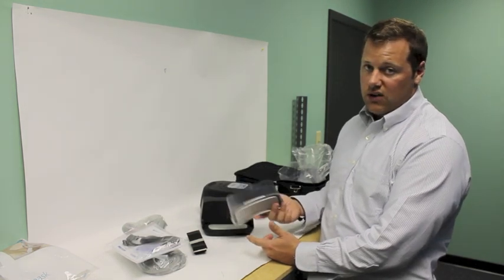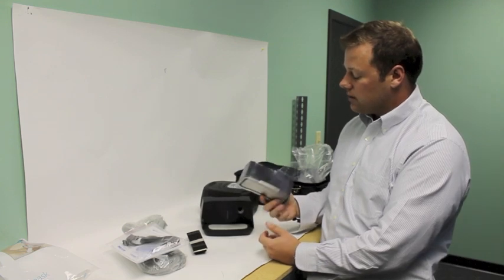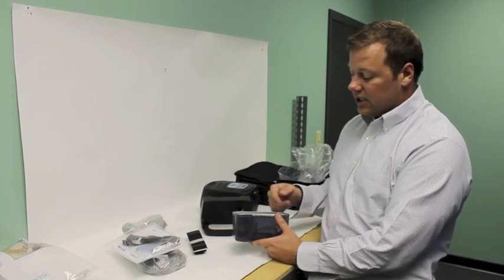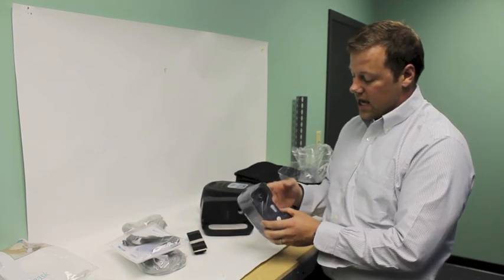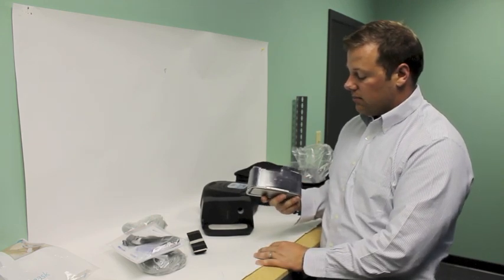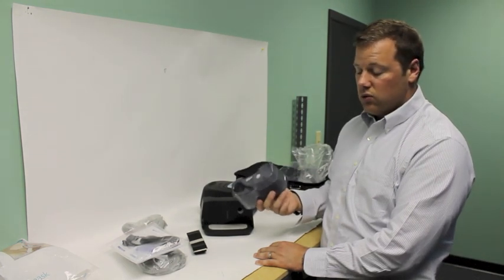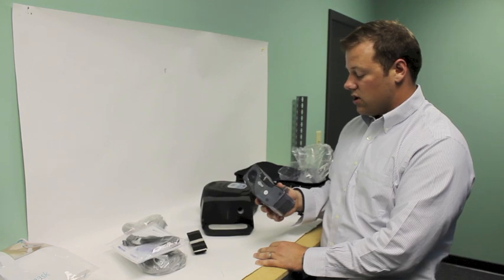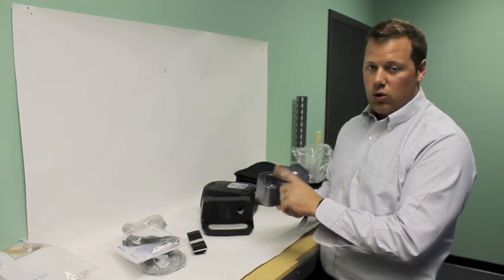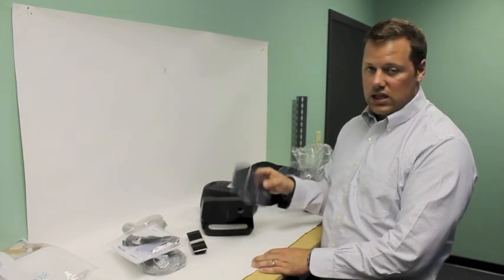In fact, every day you should be emptying out and drying your water chamber just so nothing builds up in it. Unfortunately though, with this water chamber, it is not a cleanable water chamber. There is no way to actually get into this thing. It's all one solid piece. So we'd recommend that you buy a new one once a year, or once every other year, but there's no way to actually clean these besides putting 1 part water, 1 part vinegar in here, sloshing it around a little bit, then dumping it out and letting it air dry.